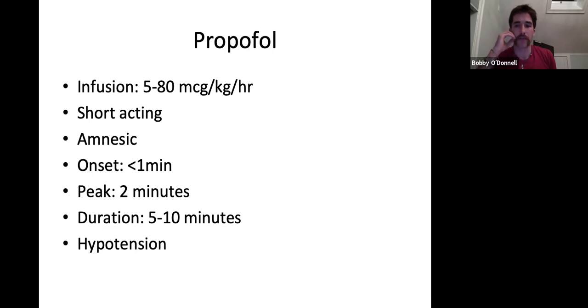Because oftentimes you'll go into Huggins or you'll go into Lakes or Spear, and they're going to be on a propofol drip, and they're going to be mildly hypotensive, and they're not going to be tolerating the vent, and they've kind of maxed out their propofol, and their solution is to give them Versed, which is also going to affect their hemodynamics. When in reality, if there's not a contraindication, I'll generally always ask for ketamine.